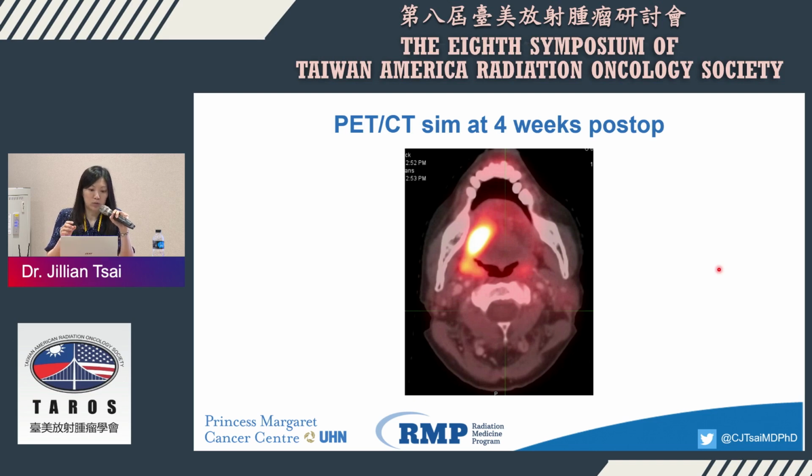Probably you can skip those like T1, T2 small tumors that you are not very worried about, if there's a resource or time constraint. But for very nasty disease like this, you almost always want to order a post-operative PET-CT or at least a good diagnostic MRI, because you really capture the recurrent disease, and that will totally change your management. Okay, so then you order a post-operative scan, and then that shows something like this.